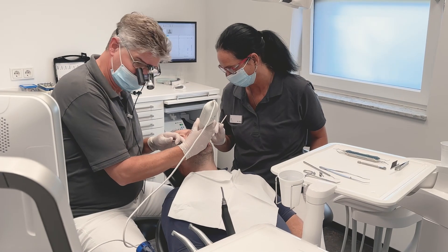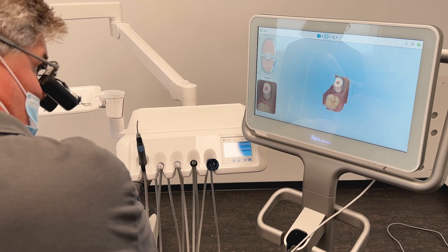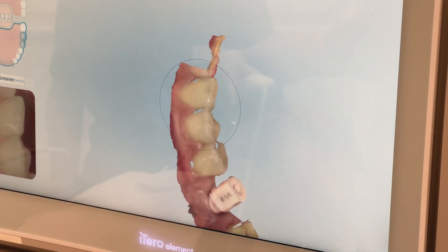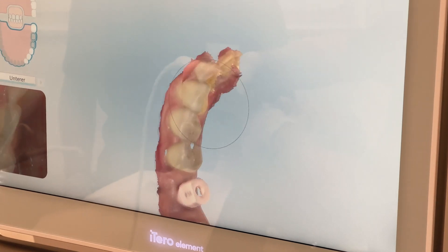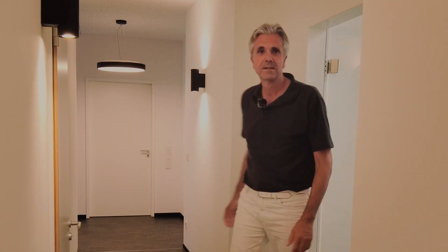Digital impressions simplify many aspects of the process chain because the software is compatible with the subsequent steps and all the data in the system is directly linked to the patient. The first step is completed. The restorations are scanned and the data is sent from the scanner. I would like to show you what we do with the data, how we design and then mill the restoration.